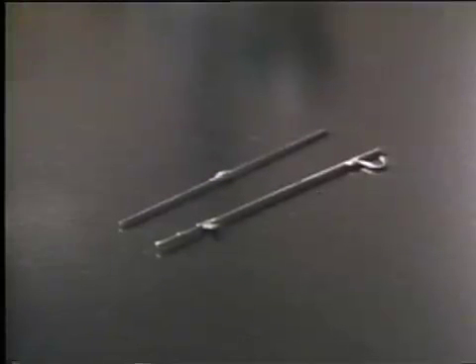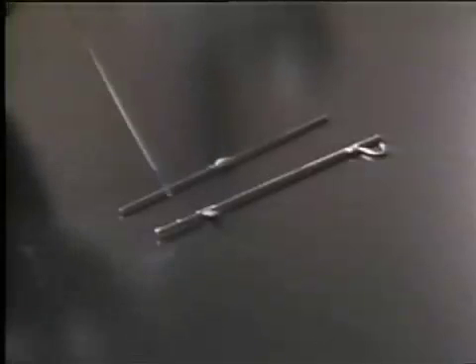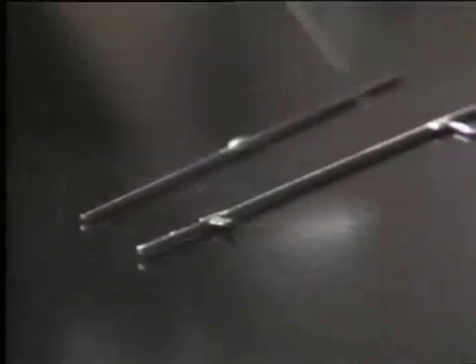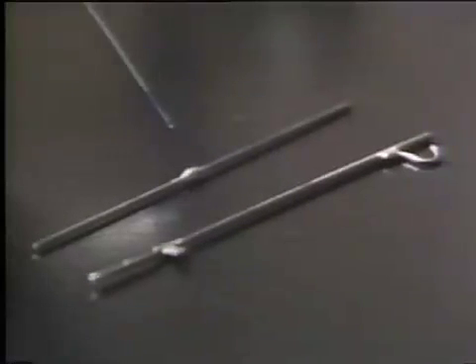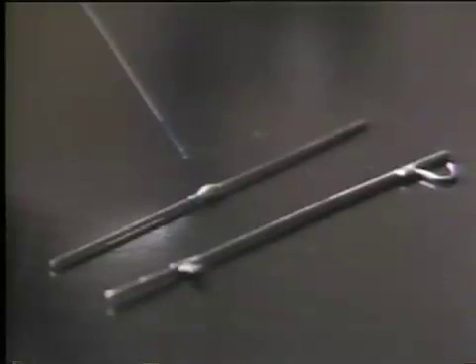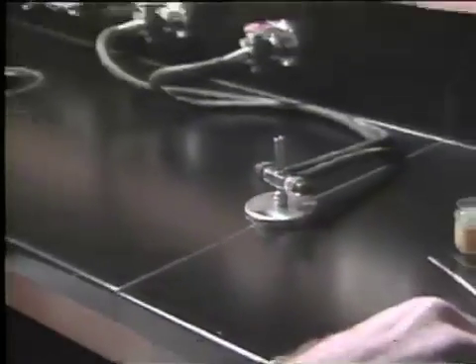Two technique exercises will be demonstrated. A gold technique exercise constructed of .038 diameter wire, with a gold butt joint, a gold Mershon post, and a stainless steel hook soldered to the main gold wire. A stainless steel butt joint will also be constructed, with stainless steel solder joining two pieces of .030 diameter stainless steel wire. The first step in soldering technique is the lighting of the orthodontic blowpipe to obtain the necessary heat for the soldering process.